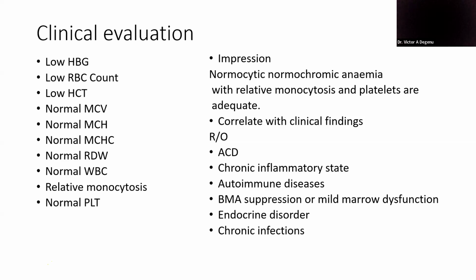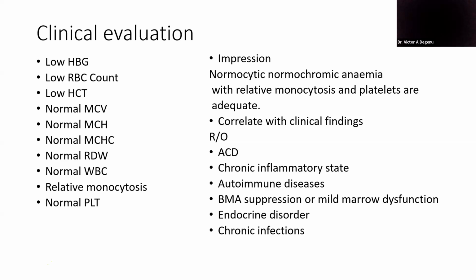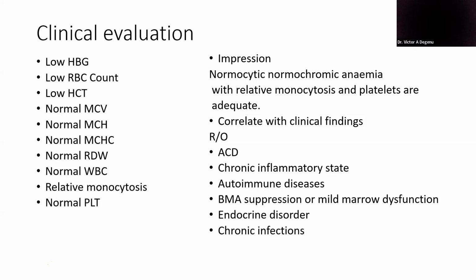Any question? Hello, Doc. In interpreting the full blood count results, I was also expecting that the histograms and the scattergraphs would be attached to the results so that we'd be able to appreciate them. In fact, I wanted to do that, but I thought it would be another fine opportunity for us to look at interpretation of histograms alone. That is why I did not bring the pictures of the histogram.